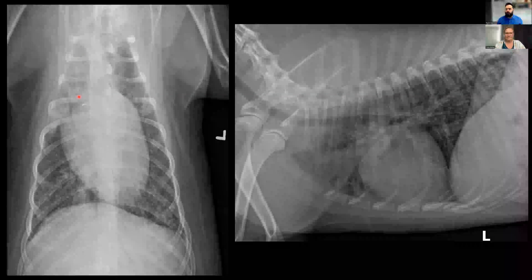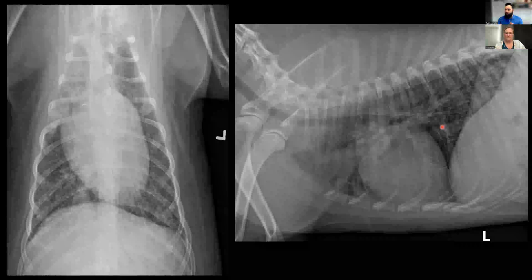Throughout the thorax, especially visible in the caudodorsal thorax, there are numerous small, almost punctate-like nodules — we sometimes call this a miliary pattern, where the lung pattern looks like millet seeds. This fine nodular pattern is often implicated in specific diseases. We also have portions of the lung with a hazy increase in opacity, especially in the left caudal thorax, obscuring vessel margins and showing increases in opacity along the airways. So we have basically a component of every different pulmonary pattern in this one patient, which is challenging but helps us narrow our differential diagnosis list.